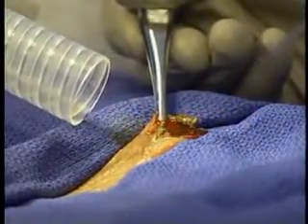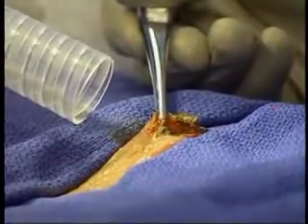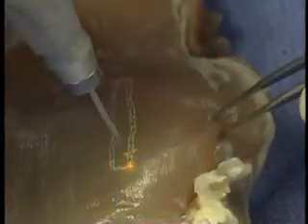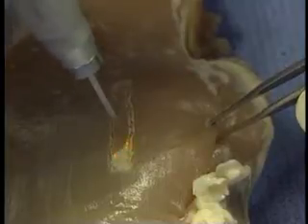Out of over 1,000 different mediums developed to create laser energy, only about a dozen laser systems are used for everyday clinical applications in healthcare. When handled properly, healthcare laser systems are safe and effective. However, never underestimate the potential danger these powerful, intricate, and technically demanding surgical devices pose.